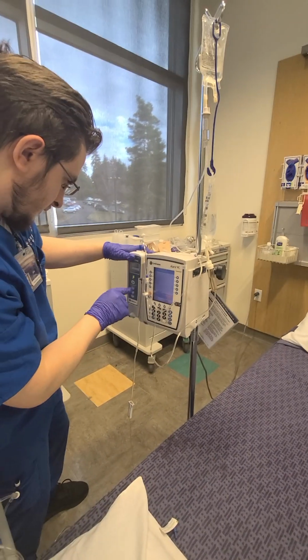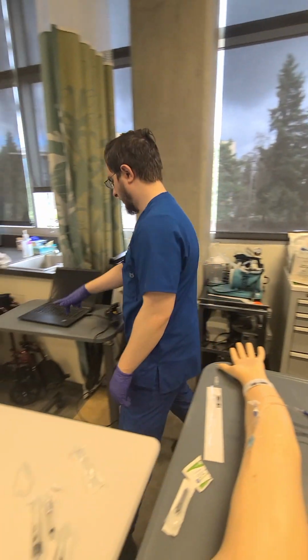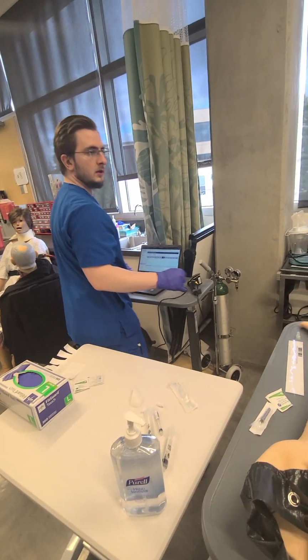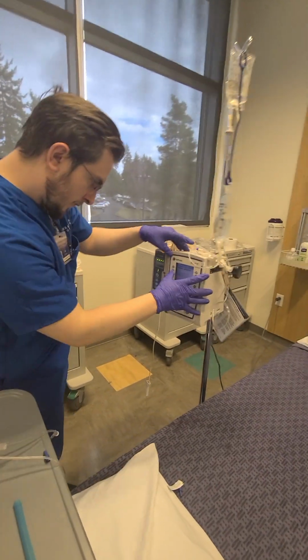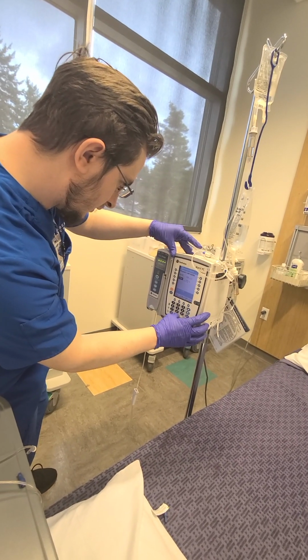Confirm. Channel select. Basic infusion. I'm going to check real quick. I know what it was, but just to make sure that it's good. Normal saline, 125 milliliters, 1 liter or 1,000 milliliters. Good. Rate, 125. Enter. Volume to be infused, 1,000 milliliters.